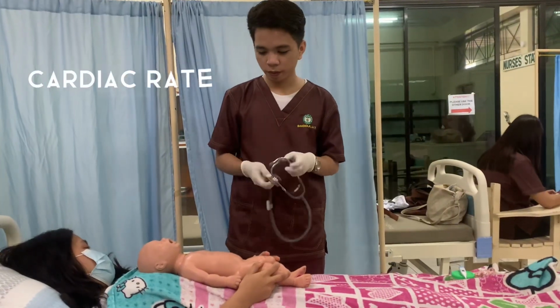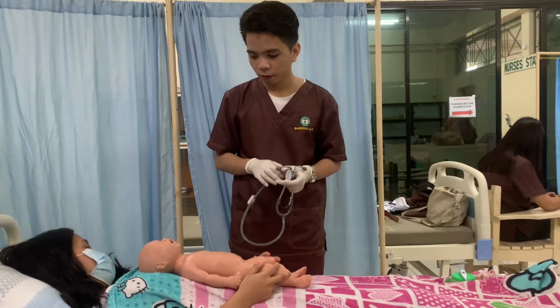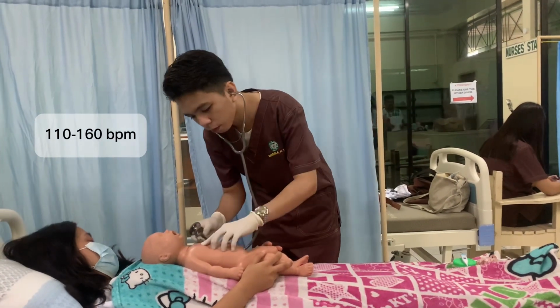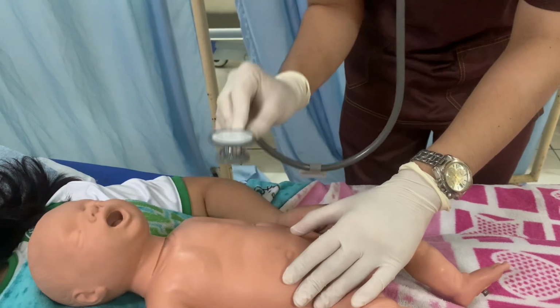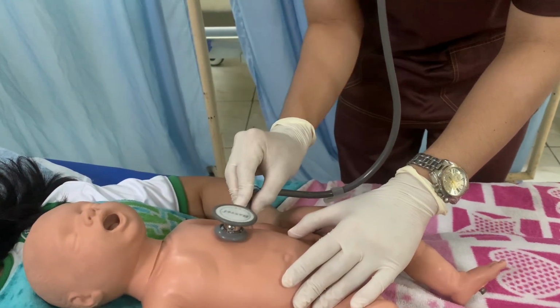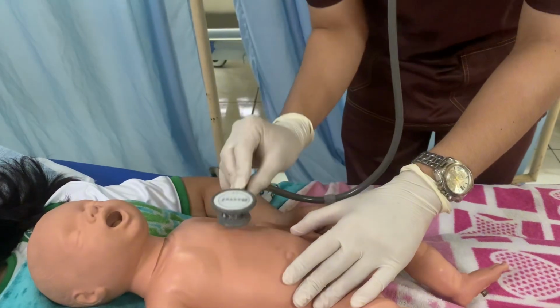For the heart rate or cardiac rate, use an appropriate size diaphragm and bell for the newborn or infant. The normal heart rate is 110 to 160 beats per minute. The apical pulse on an infant is found at the fourth intercostal space, lateral to the mid-clavicular line. The heart rate is going to be fast, so it will take you practice when learning how to count the heart rate on an infant or newborn.